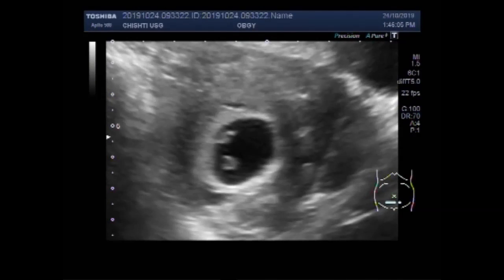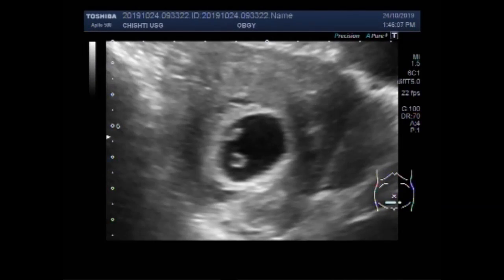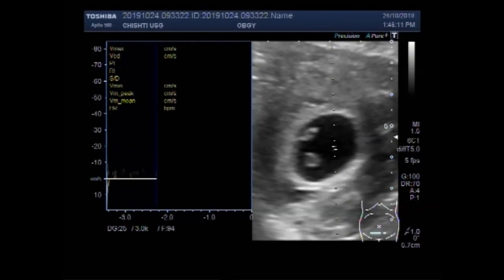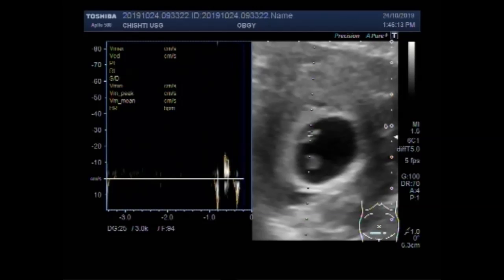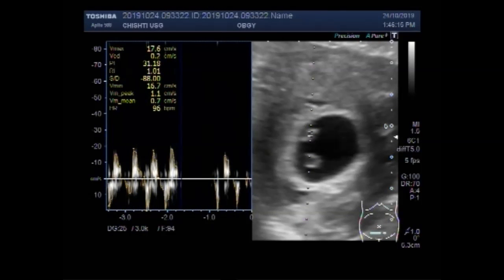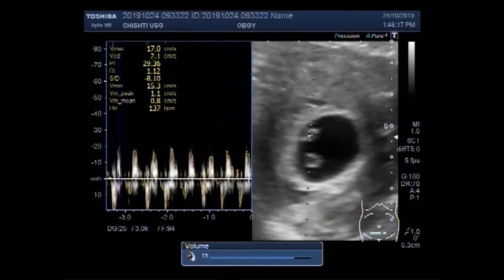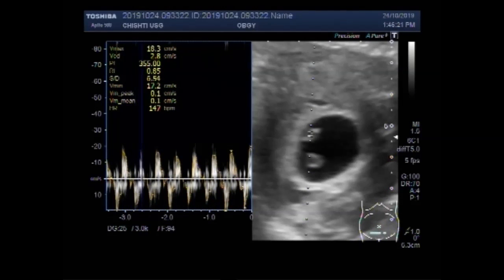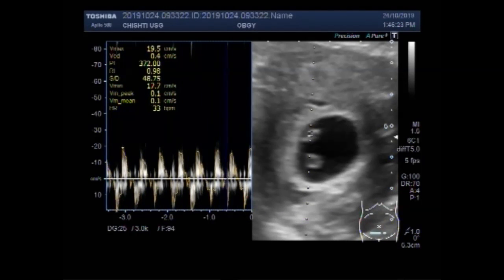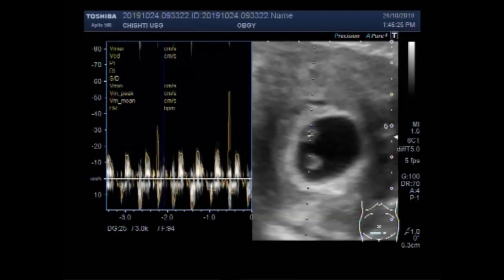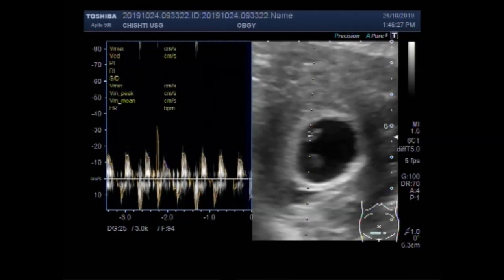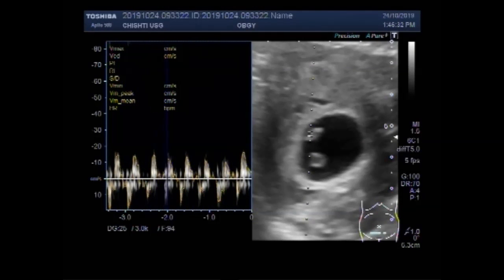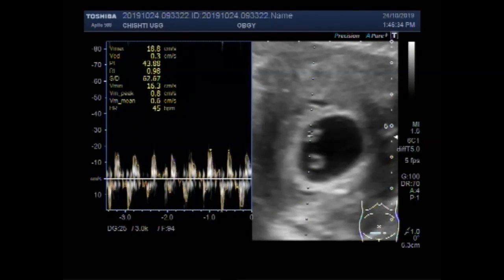Now you can see cardiac activity in the embryo. Cardiac activity is visible and audible. Fetal cardiac activity is seen.